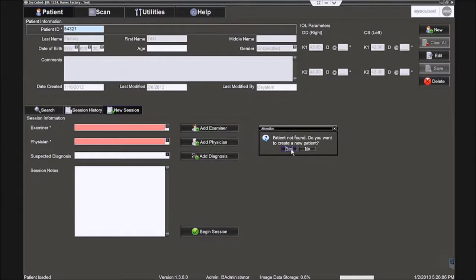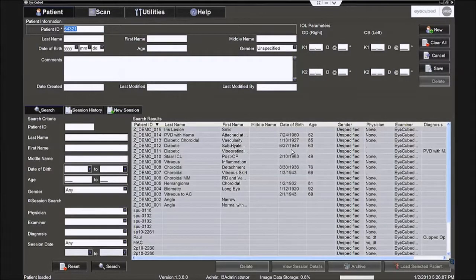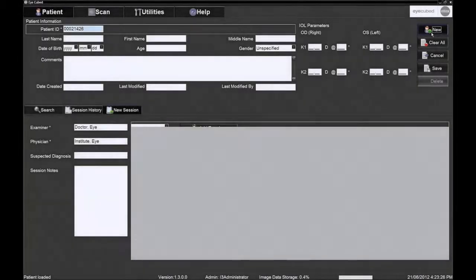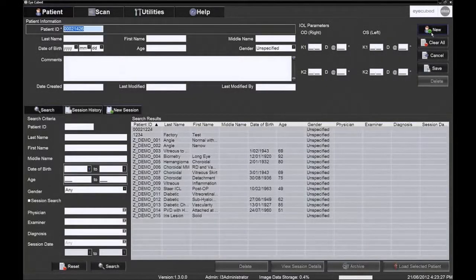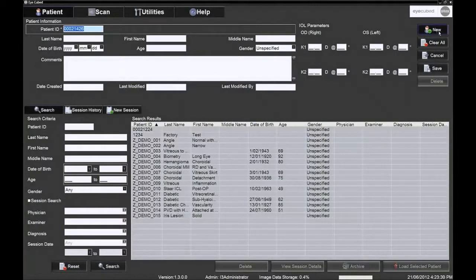Entering a new patient ID prompts the user to answer yes to creating a new patient. As an alternative, the system can automatically generate a new patient ID. See option in the general tab under utilities.